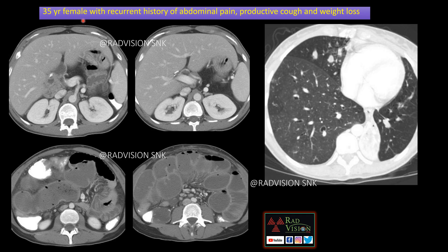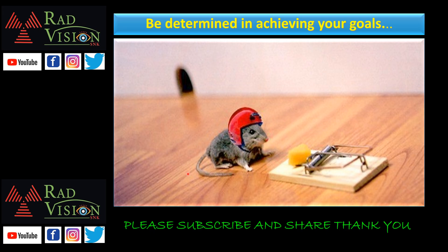Next case: a 35-year-old female with recurrent history of abdominal pain, productive cough, and weight loss. You can see the pancreatic head, body, and tail are not visualized — they are completely replaced by fat, suggestive of pancreatic lipomatosis. There is also dilatation of bowel loops suggestive of intestinal obstruction. On CT chest, there is mosaic attenuation, bronchiectasis changes, patchy consolidation areas, and lung collapse. Whenever you see pancreatic lipomatosis with intestinal obstruction and bronchiectasis with lung changes, definitely suspect cystic fibrosis. This is the last case — thank you all.